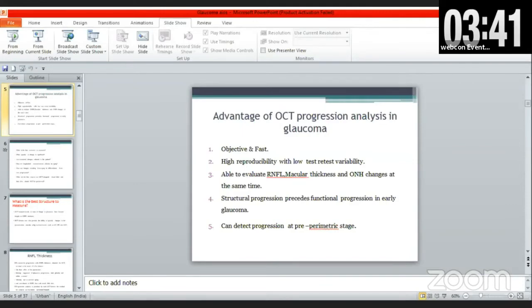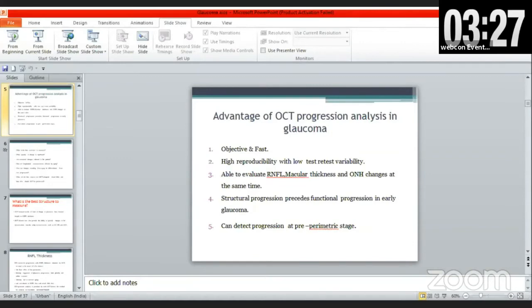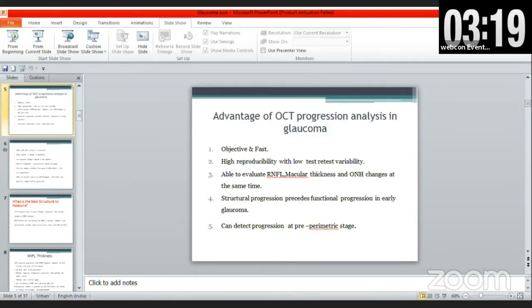The GPA analysis of the ganglion cell layer similarly shows baseline measurements with color-coded deviations: red indicates likely loss and orange indicates possible loss. Average GCL and IPL thickness — superior and inferior — are plotted, with cumulative data used to generate the progression graphs.